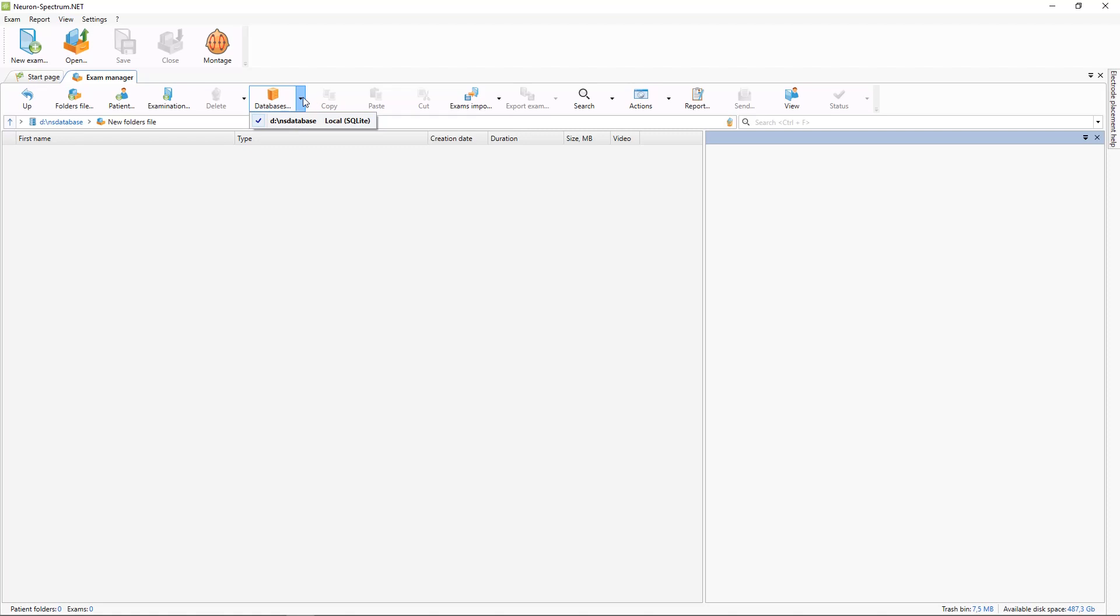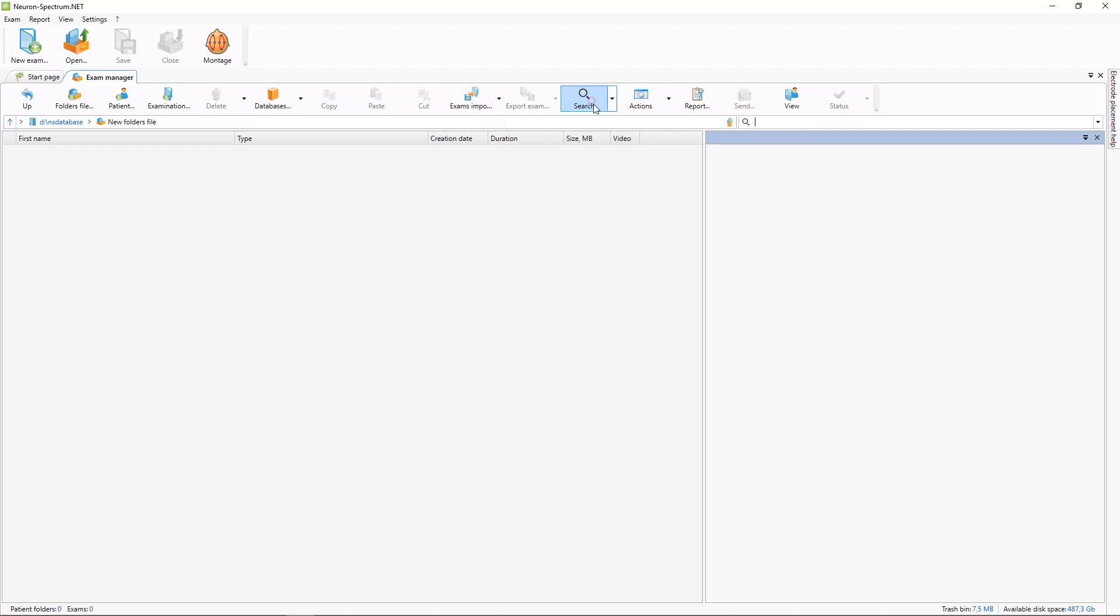You can copy, paste, or cut selected examinations. You can export and import them to archive files. You can make searches through your database.